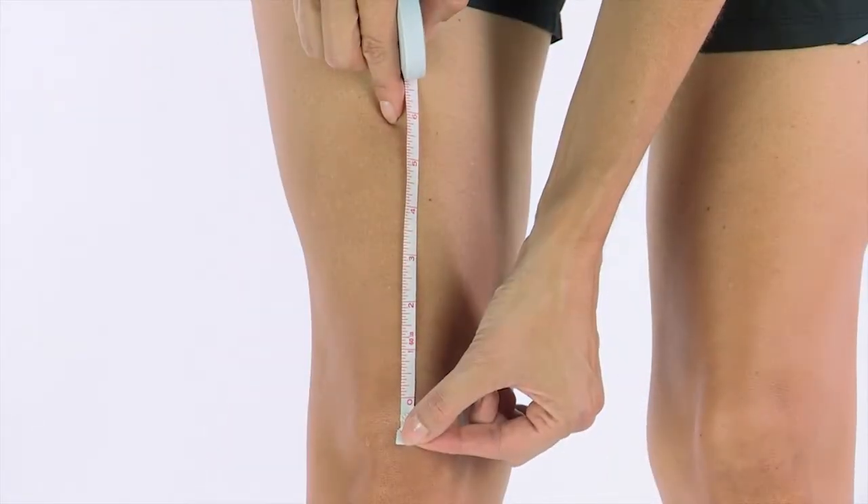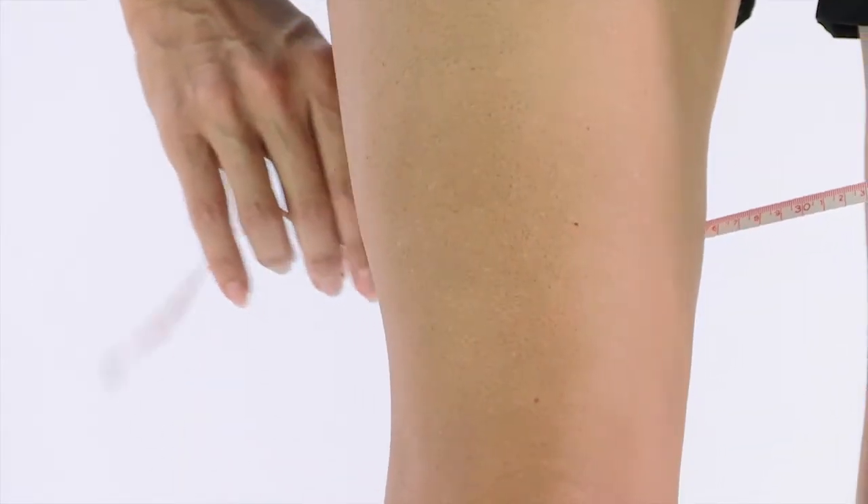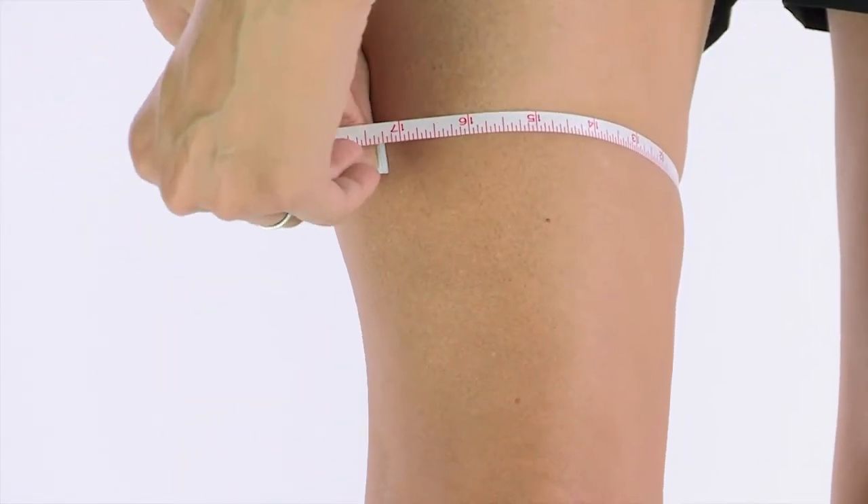Next, measure 6 inches up from the center of your kneecap. At the 6-inch spot, measure the circumference of your thigh.